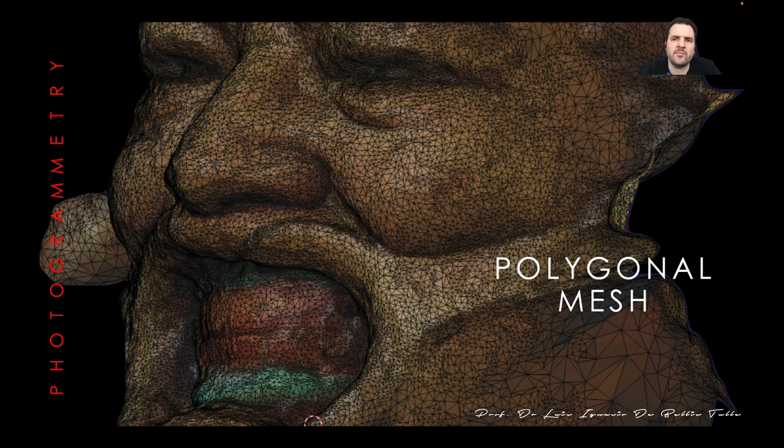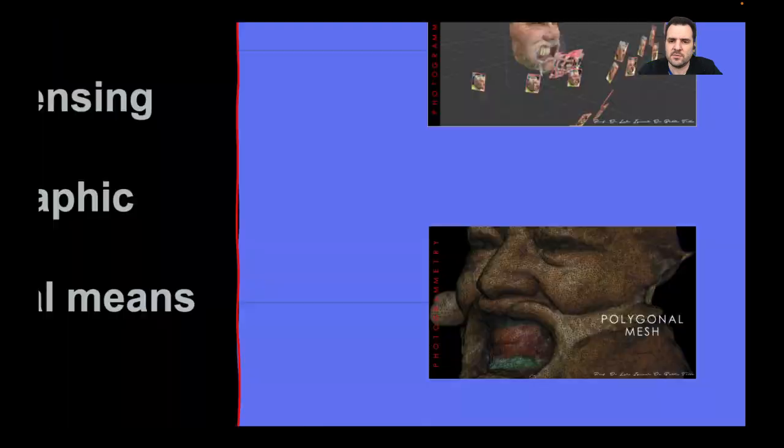It's easy to do, but the main problem that we get with this kind of technology is that we don't get a mesh that is even. We get uneven meshes. And that's a problem because when we're trying to work in different software, these kind of meshes or polygons are going to give us faulty results. So we can use this, but it's not what we want to get because it's going to make us work more in the post-processing of all this data. So it's a nice way maybe to start and know the 3D world.